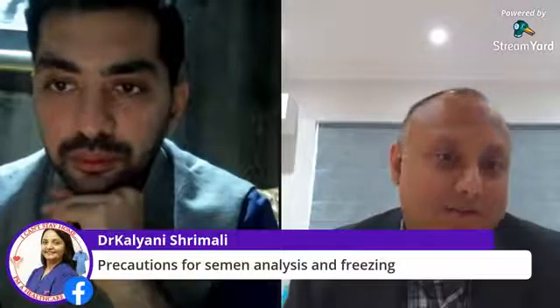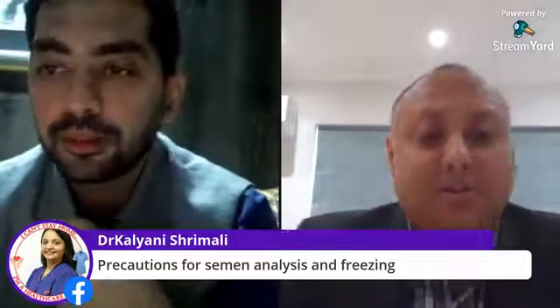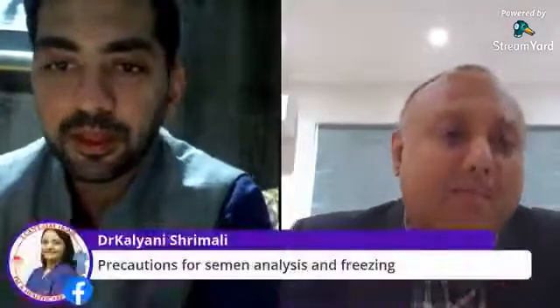Absolutely. So, yes, there are some steps which are going to be very difficult to perform at social distancing, but I think we can certainly identify many areas whereby we don't need to. So, I give you another example. When we prepare semen, of course, we try and prepare one sample at a time, which is usually the practice in many labs.